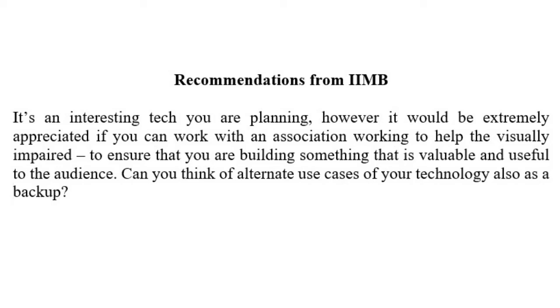The field of sensing obstacles is restricted only to a very small radius, which is one of the major concerns for the visually impaired. They cannot rely only on the audio output of the device due to the presence of external sound. Audio output alarm systems help the visually impaired person in a low noise environment. In an environment with high noise from multiple sources, for example crowded places, markets or junctions, it is natural instinct to judge incoming danger by listening to the surrounding noise. Thus we overcome this flaw by using a vibratory sense or output volume control.